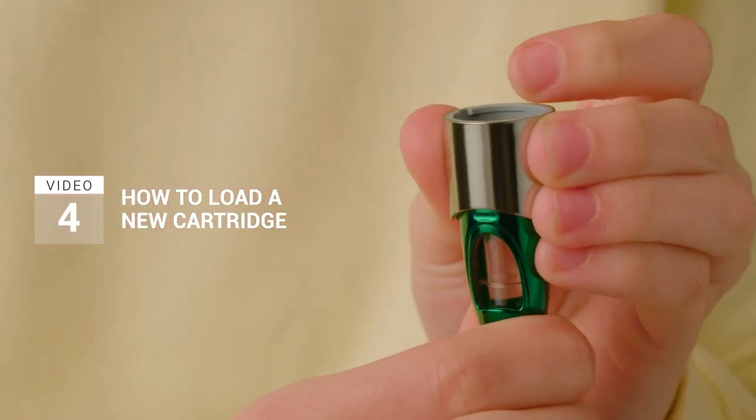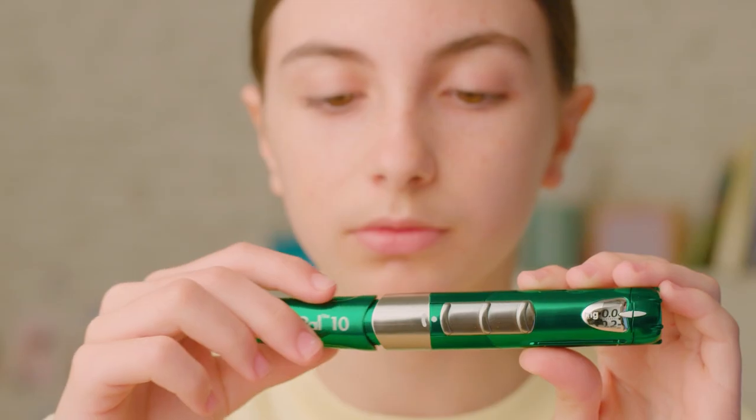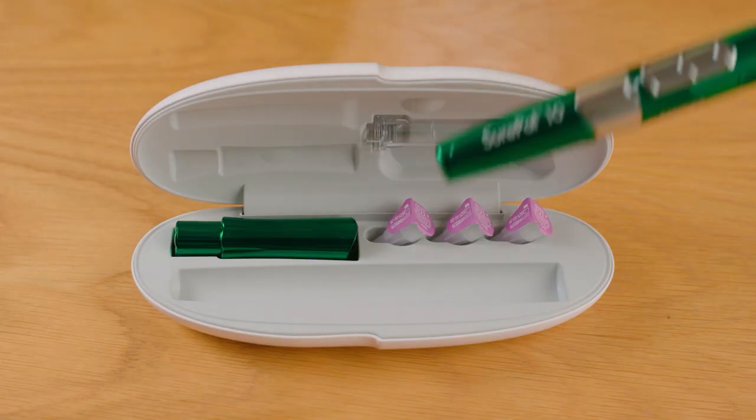You can then reattach the locking ring with the new cartridge. Attach the pen cap and return your pen to the hard case.